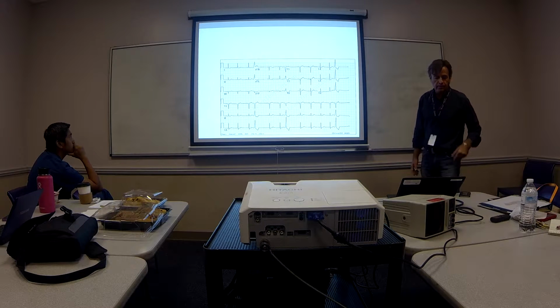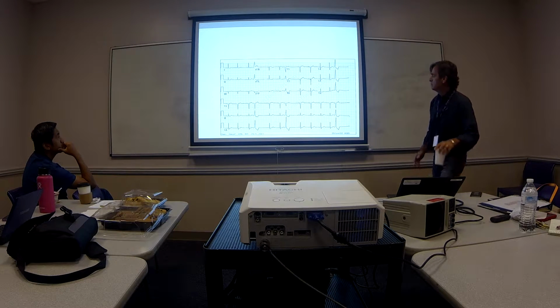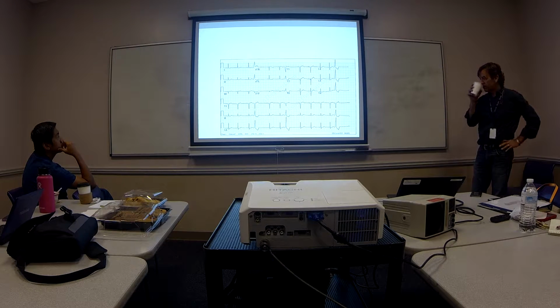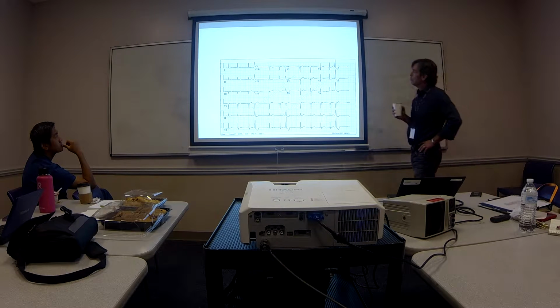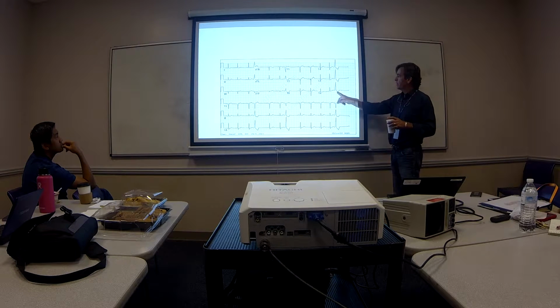Okay, what's happening here? What's abnormal? ST depression in V4, V5, and V6 on this one here? Yeah. Okay, so there's something different going on, right?